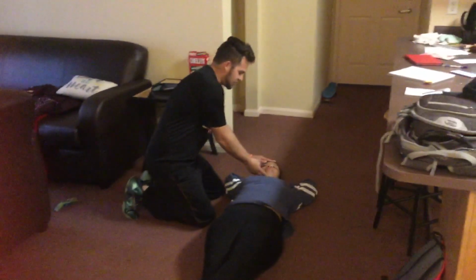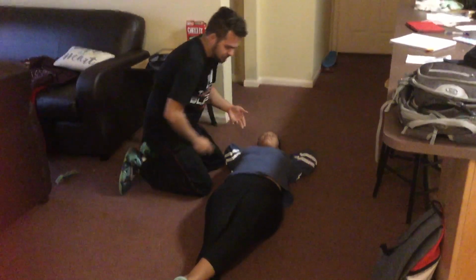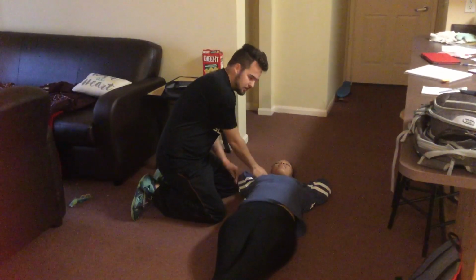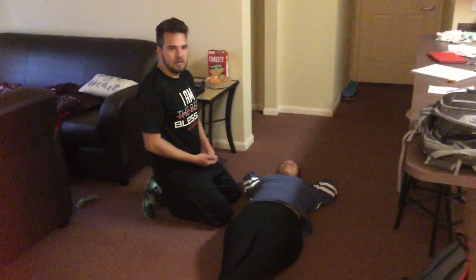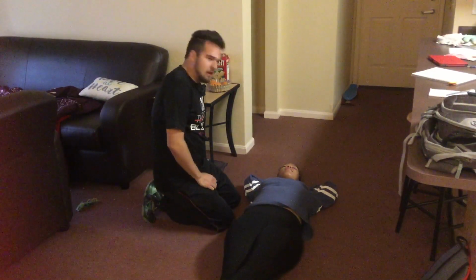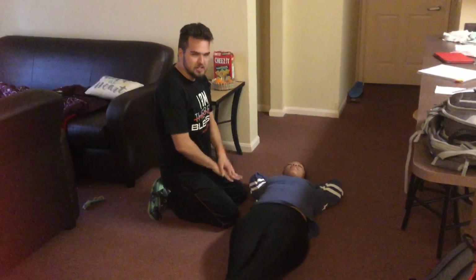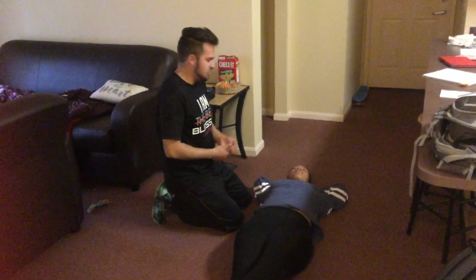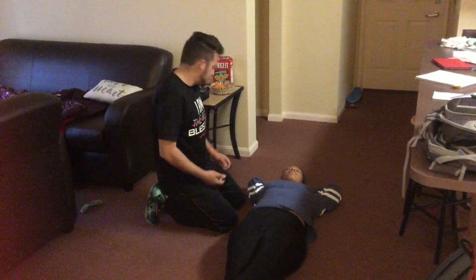So you would tilt their head back, listening for breathing, looking for the chest to go up and down, as well as the pulse as you're checking. There's no pulse here, so at this point I would have someone call 911, grab the AED, and at that point I would begin CPR. 30 chest compressions with 2 rescue breaths, about 5 cycles or so, until I assess again, looking for pulse, looking for respirations, anything like that.